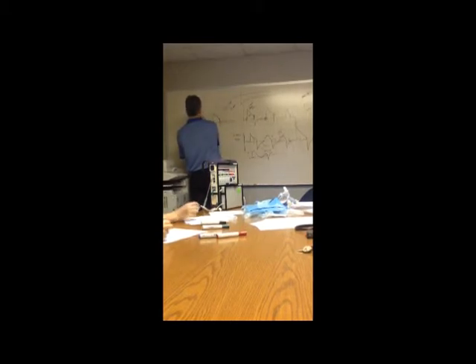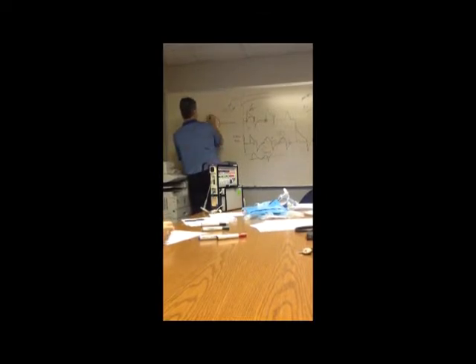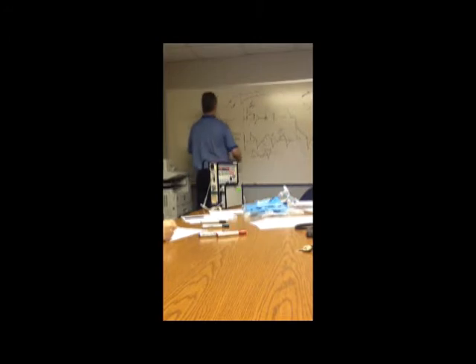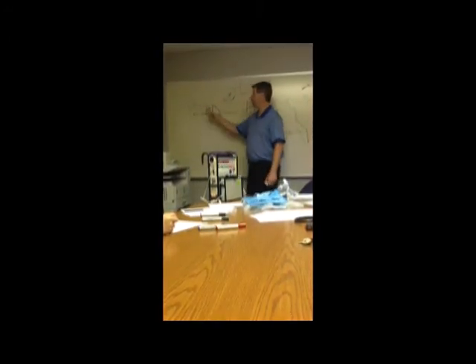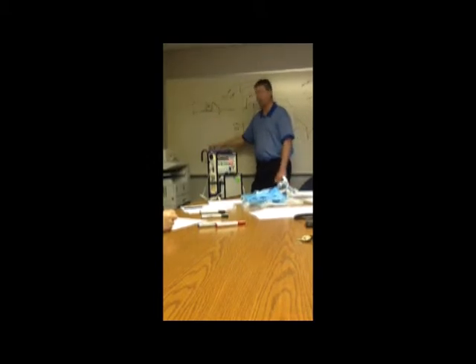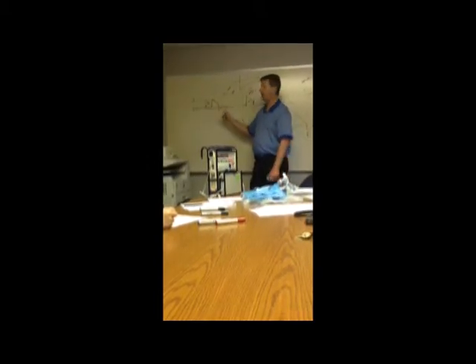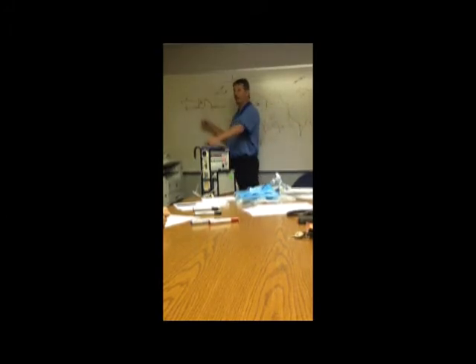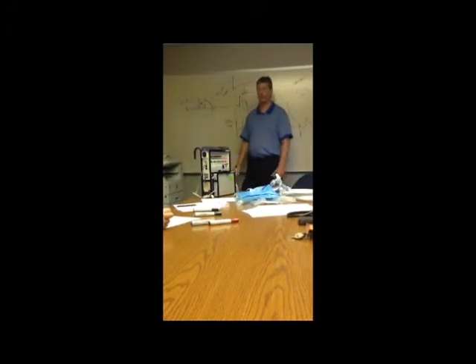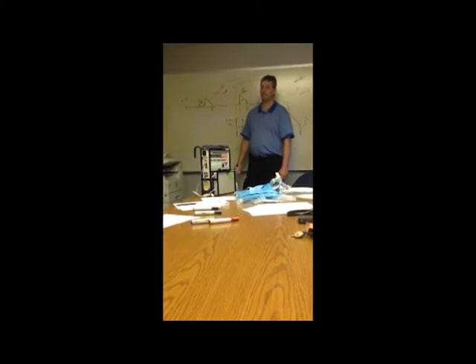So on yours, if you dial 20 in, they go all the way up to 25, because what you added is 20 of PSV. So you're going to peak at 25. If you get somebody on 20 over 5 on a BiPAP machine at the hospital, and you want to do the exact same, you're going to set yours at what? 15 over 5.